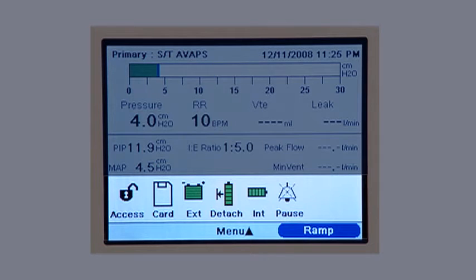Now, let's move on to the status panel at the bottom of the screen. Various symbols appear here to show what features are activated. You may see an open lock, which is an indicator used by the home care provider. You see this symbol when the secure digital, or SD memory card, is in the slot. If you see this one, there's an error with the SD card.